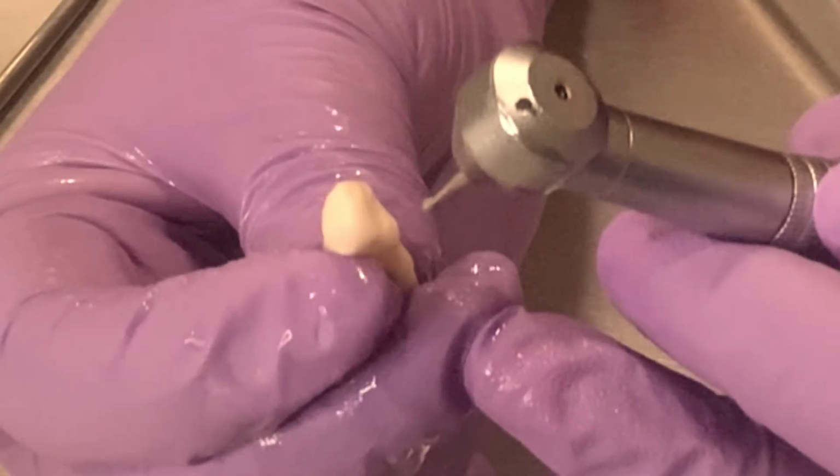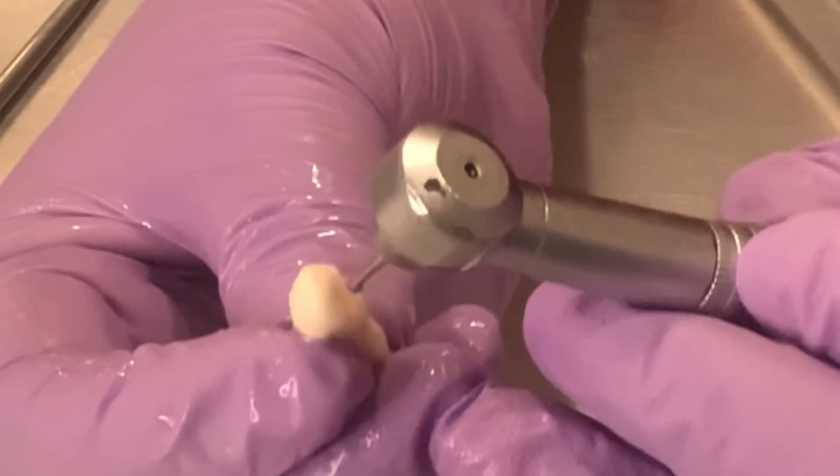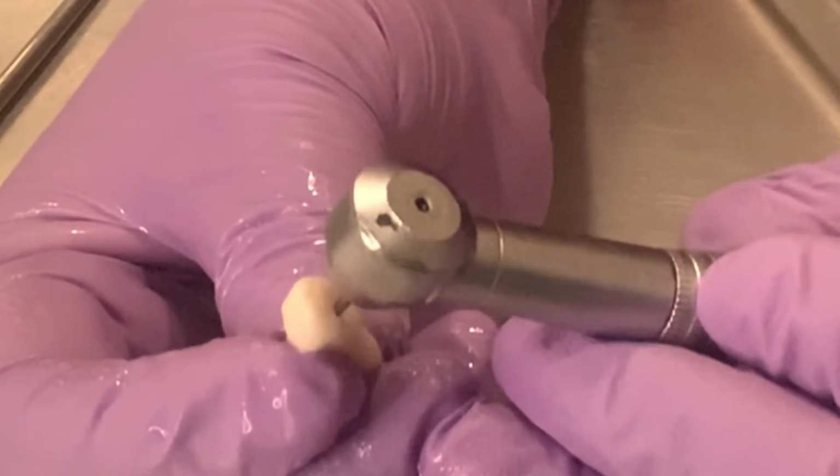The cutting is done till the pulp chamber is reached, and then a significant drop of the burr into the chamber can be felt.